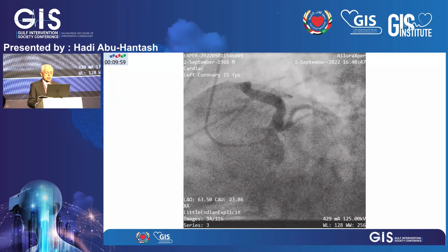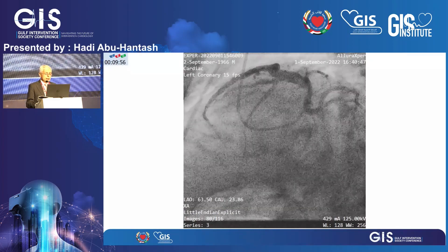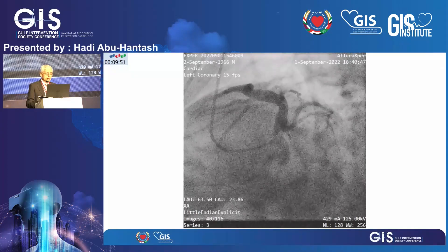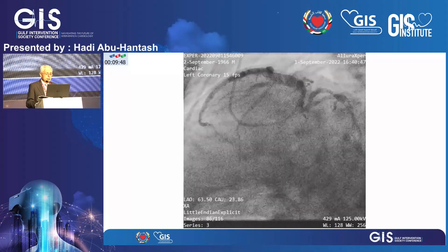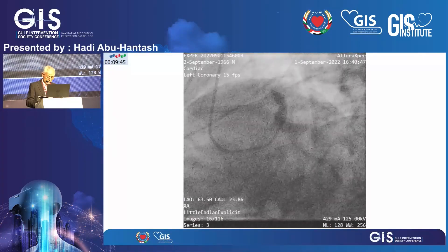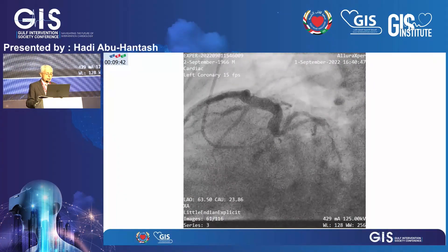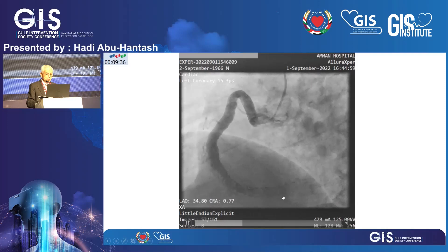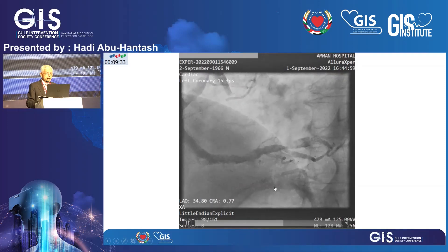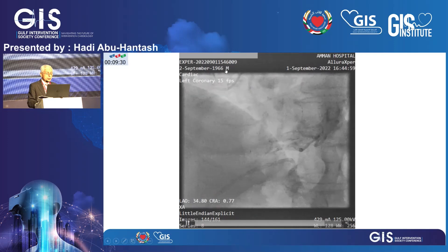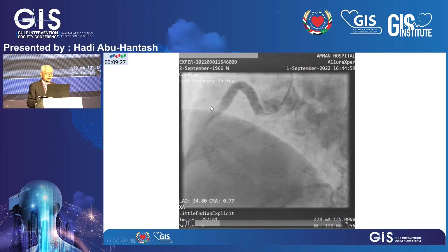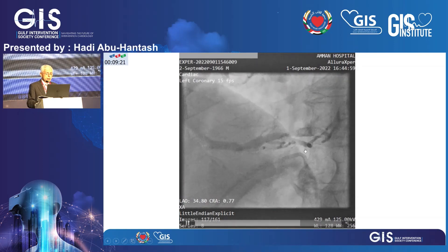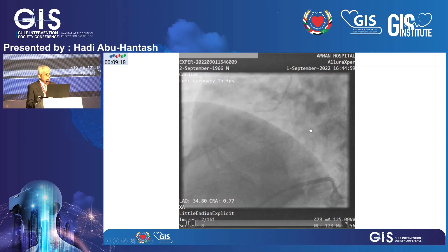Radial approach. I usually use a guiding catheter from the start rather than diagnostic then switching to a guide. The left system showed a large ectasia in the LAD; the circumflex was relatively small with no stenosis. On the right side — he had bariatric surgery in the past — there is a large ectasia in the right coronary artery, and in the posterolateral you can appreciate a huge thrombus sitting there, though the TIMI flow is not bad — more than two.